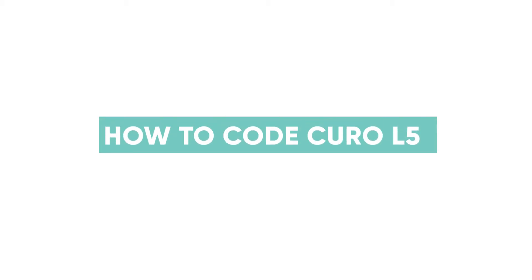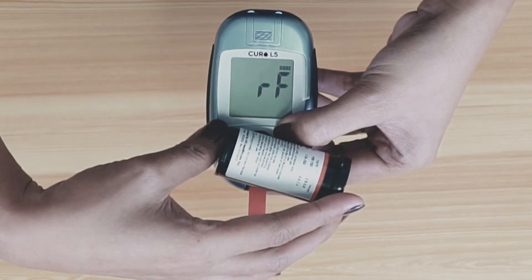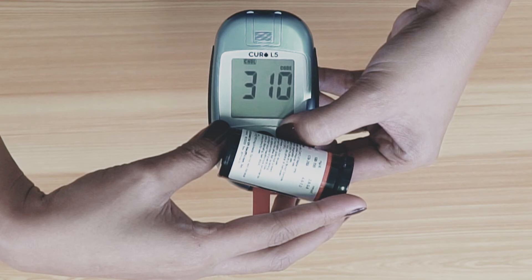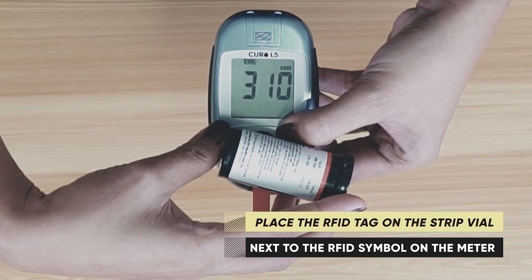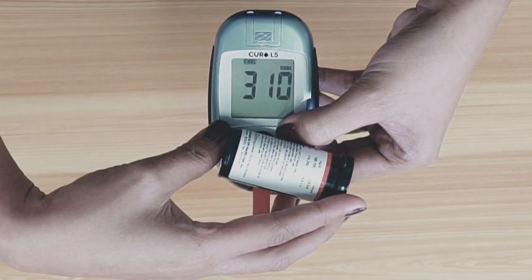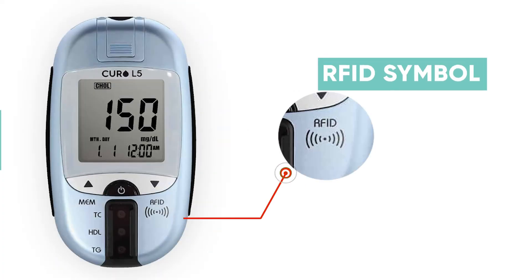To code your Curo L5 device, hold the down arrow for 3 or more seconds. You should see Code RF on the screen. Continuously hold the down arrow for 3 or more seconds while placing the RFID tag symbol on the test strip bottle next to or against the RFID symbol on the Curo L5 device.